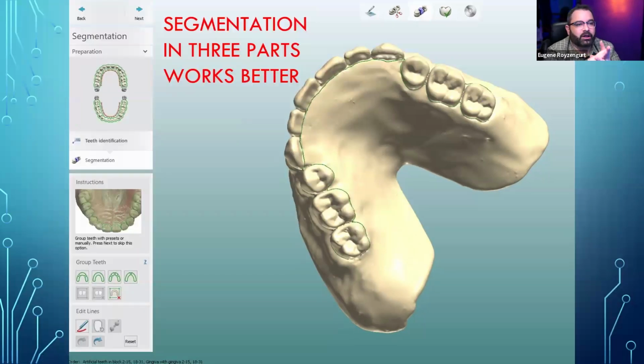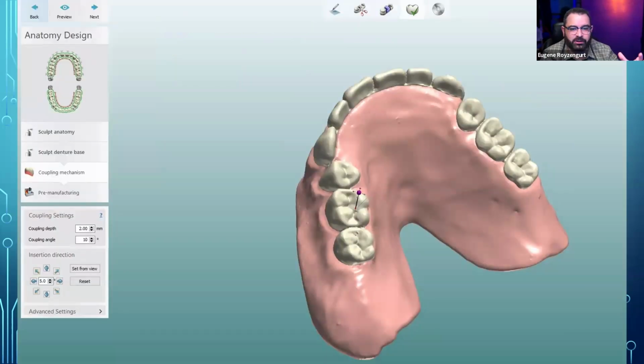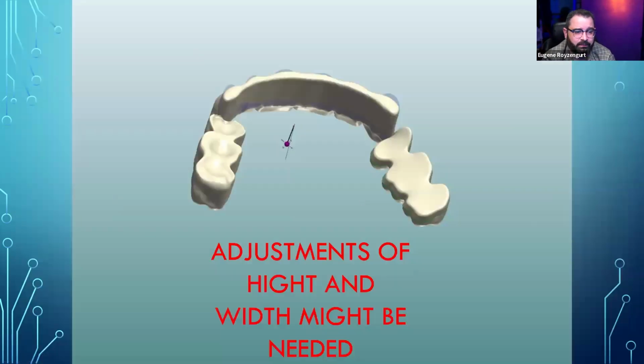Once the teeth are marked, you have to segment the denture into the tooth side and the base plate side. You can see right here, you can do a full arch, or 3 parts, 4 parts, or 2 parts. I don't recommend doing it in one part, because I tried that and you usually run into issues lining things up if you do it as a single piece. So the way I do it is usually in 3 pieces, an anterior and 2 posteriors. Okay, and then it tells you about the coupling mechanism and the angulation of insertion. I don't usually change the angulation of insertion because I don't want to mess things up, okay?